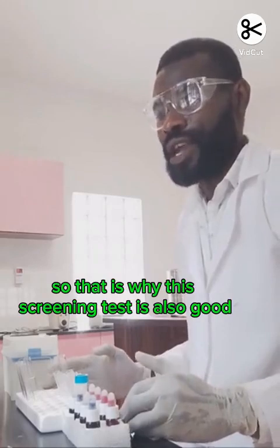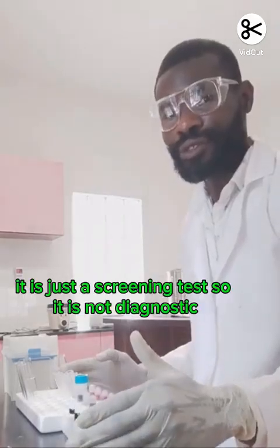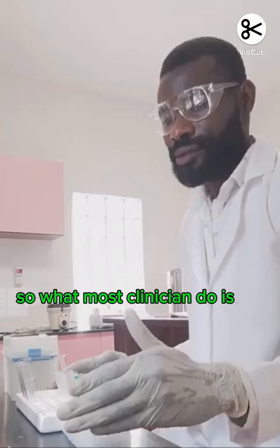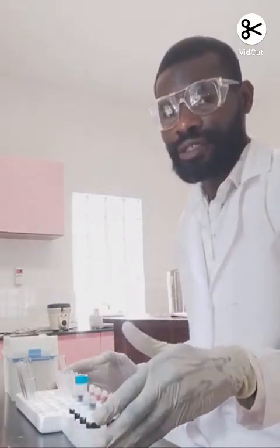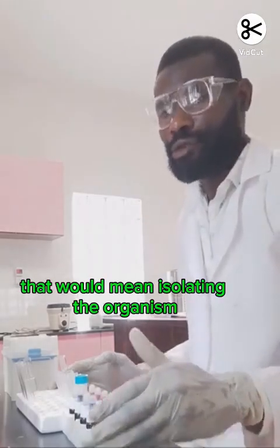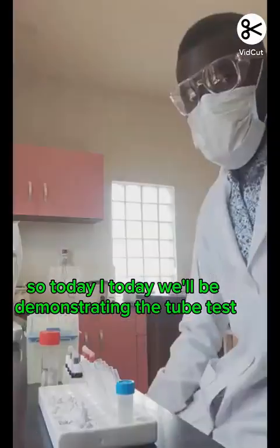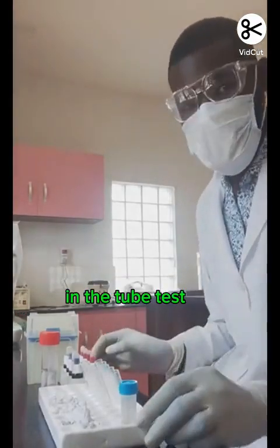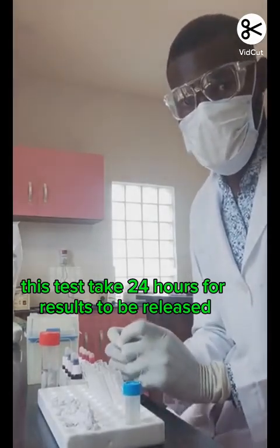That is why this screening test is also good. It is just a screening test, so it is not diagnostic. Most clinicians will use it as a basis, then request the longer test that involves isolating the organism, which will take more days. Today we'll be demonstrating the tube test. In the tube test, results take 24 hours to be released.